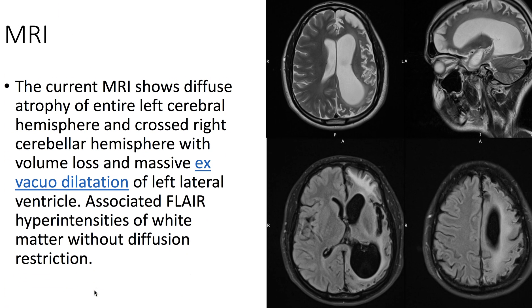On MRI, we see diffuse atrophy of the entire left cerebral hemisphere, associated with massive ex-vacuo dilatation of the left lateral ventricle. We also see associated FLAIR hyperintensities here in the left cerebral hemisphere.